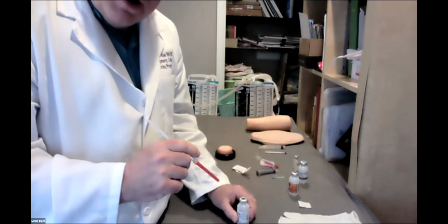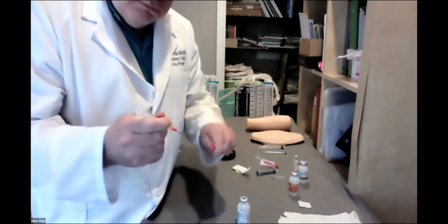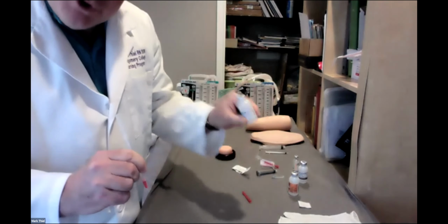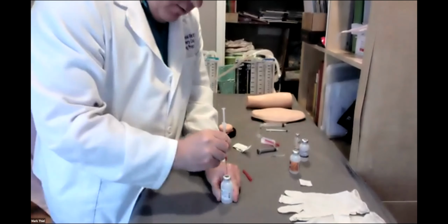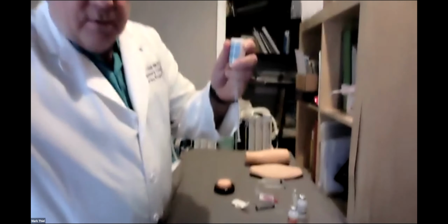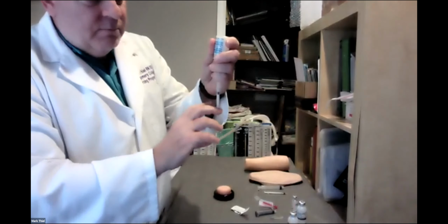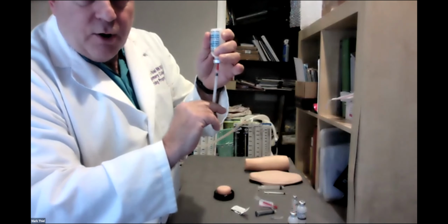I already scrubbed my vial. I am barehanded. Uncap the vial, for nurse safety that I had promised you. For nurse safety, vial down, inject. Up, two-handed, obviously to keep the needle in. Right? Inject the air.